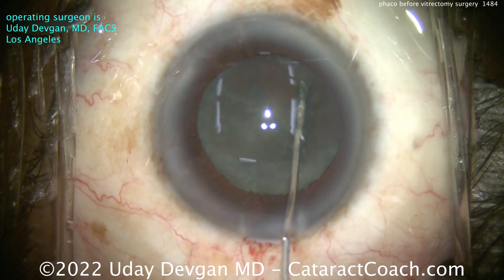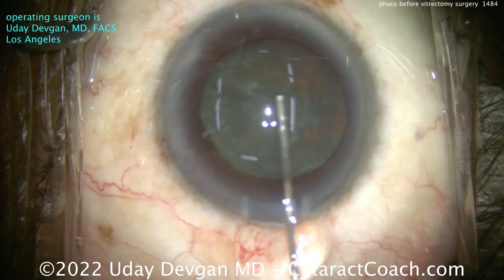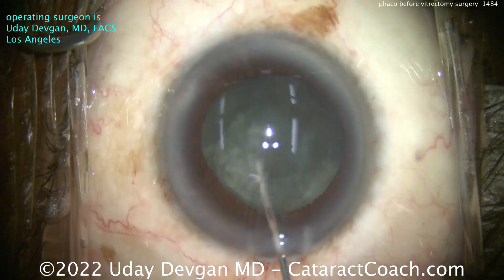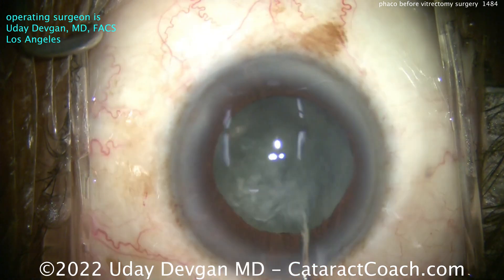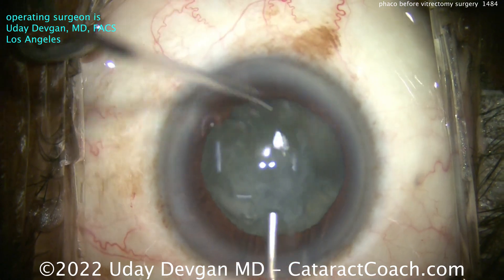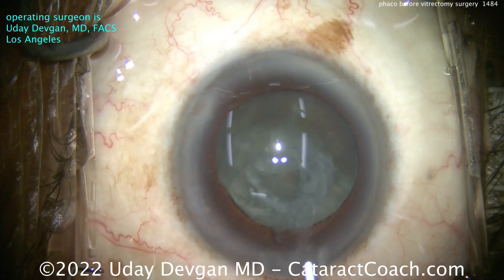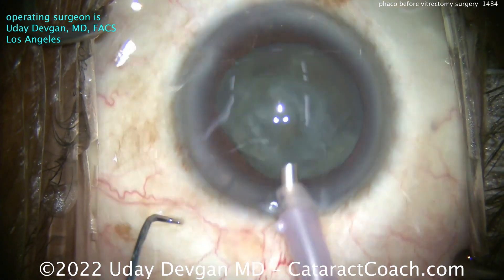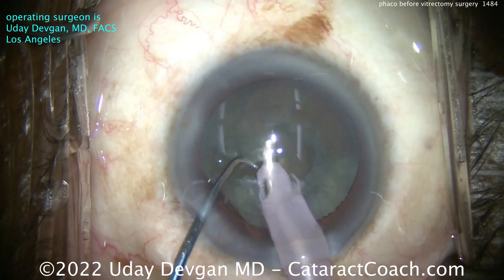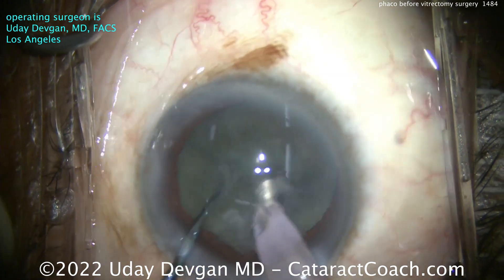The two most important things for this whole procedure are: number one, make sure the incision stays sealed — a good long tunnel length that'll seal well. I was also intentional about nicking those limbal vessels right at the incision; a little bit of bleeding is going to ensure great long-term sealing. If you make an incision that's too short, don't hesitate — put a single nylon suture in to ensure that incision stays shut. Number two is the rhexis: make it a little smaller so that even if there is posterior pressure from a gas bubble in the vitreous cavity, it's not going to push the IOL optic out of the bag.